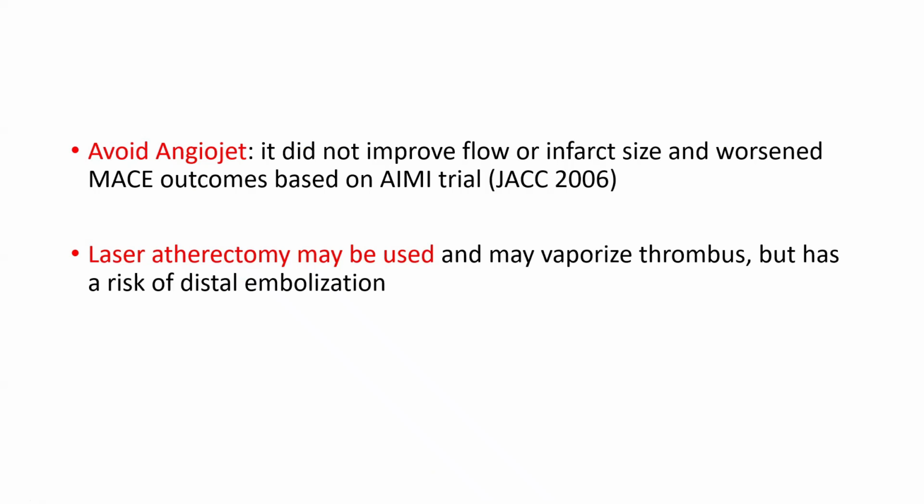Laser atherectomy is known to be an effective technique that I like to use in balloon uncrossable, heavily fibrotic or calcified lesions that are balloon uncrossables, sometimes in conjunction or in preparation for rotablation in very difficult cases. I also use laser atherectomy commonly for underexpanded stents. But laser atherectomy may also be used in thrombus and may be used to vaporize a thrombus. The problem is that it may lead to distal embolization, but that's a technique that could be considered in labs that have laser atherectomy.